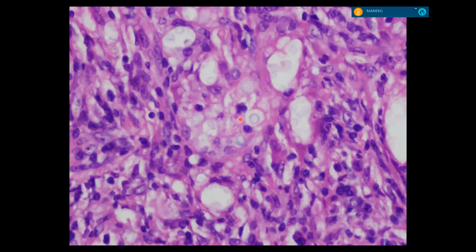a rounded structure, like this, right? This is the vacuole, and this is the rounded structure. Yes. What are you thinking? What might the rounded structure be? Fungus. Yeah, but you're jumping ahead. Like you're thinking fungus, right? Yes, I'm thinking fungus. Hyphae or yeast? Yeast. It's round, right? Yeah, it's yeast. Round yeast. So you've narrowed it down to 4 things. You're already a winner. You're down to 4.